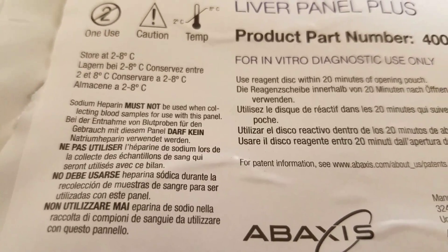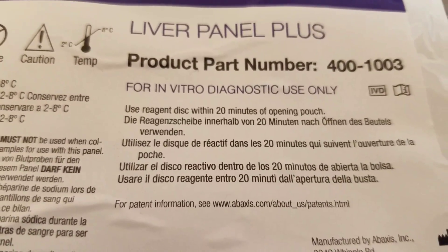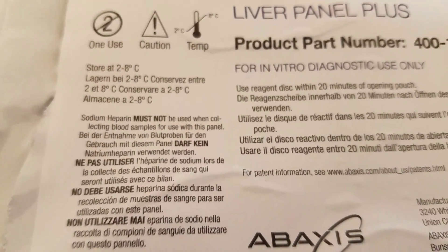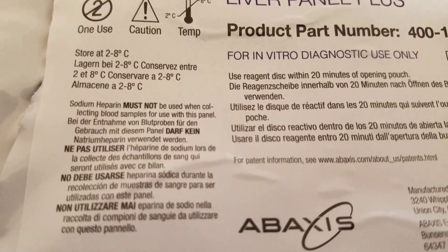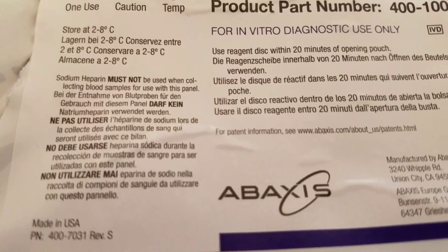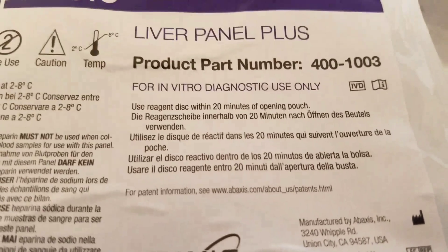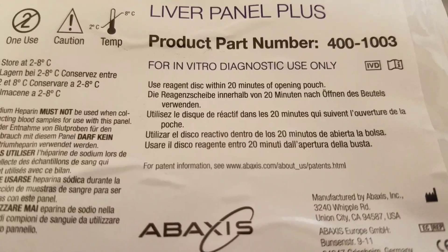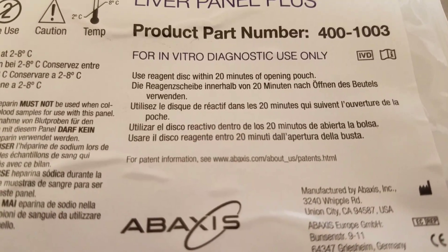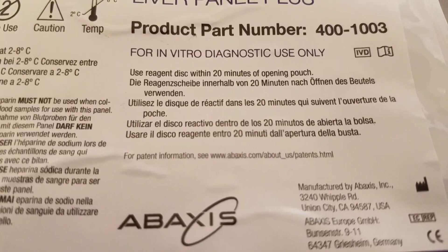One more thing I wanted to show you guys — this is on the package for liver panel plus. You have to store at 2 to 8 degrees. And you can't use sodium heparin, so you can use lithium heparin, but not sodium heparin. And we tested off whole blood. I think it can be validated for serum or plasma also. Once you open the pouch, you're supposed to use it within 20 minutes. Over here on the back, we have a lot number and then we have our expiration date.